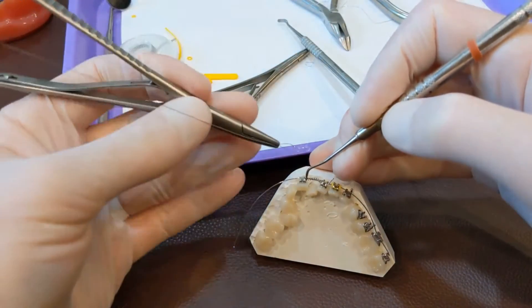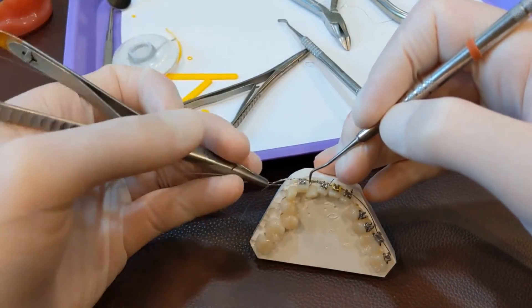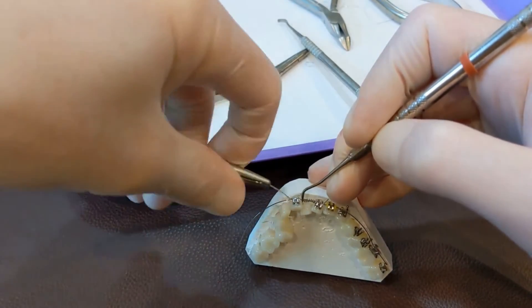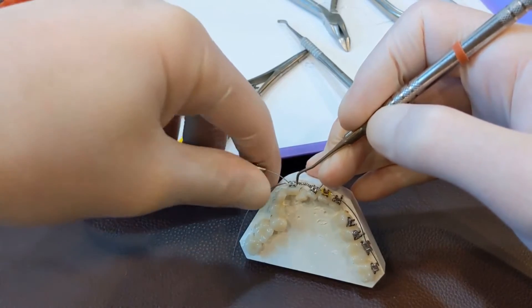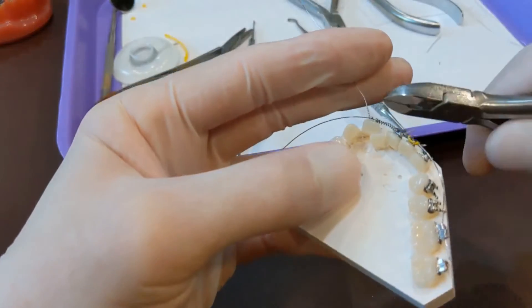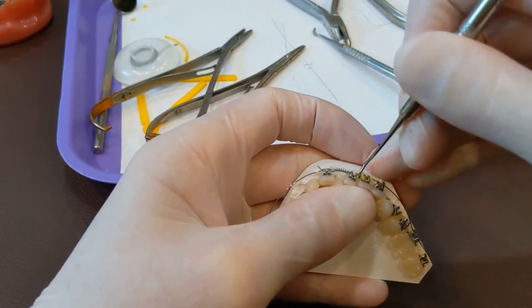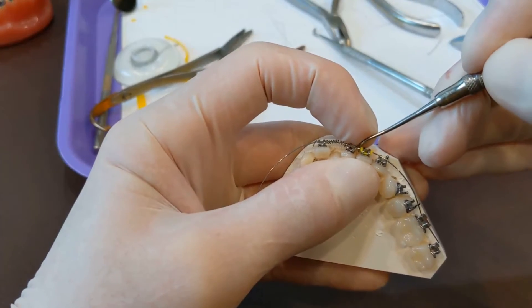Then you take your little steel tie and compress the spring back out of the way, get that slot on there, and cinch that up nicely. You cinch it up so it's firm, but not locking it down as if you're correcting a rotation, because this still has to slide along the wire. If you get it too tight, it cinches down and can't slide. Then cut the excess off and tuck both loose ends down under the wire really well so they're not going to poke anybody.